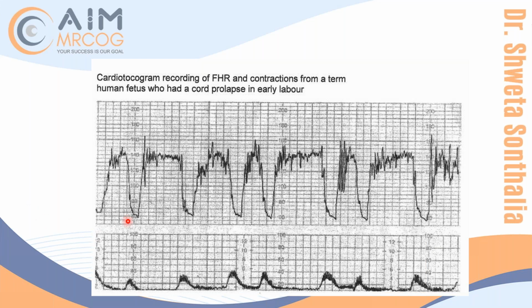They are not exactly similar. It's like the five-difference game we used to play in childhood: find five differences, find ten differences. You will find many differences. The shape, if you see, this is wider, this is narrower, this is comparatively wider. You have to have the eye to look for it. That's why I'm telling you, try to fit everything to variable unless you can't. If you see, this is an overshooting sort of pattern.